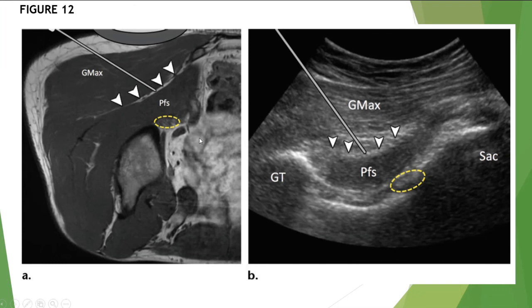So here you have the corresponding ultrasound image. It's showing the sacrum as a bone reference and the greater femoral trochanter. These are the osseous landmarks, and the needle is advancing into the fascial plane, as we saw in this diagram. It's in between the gluteus maximus and the piriformis muscle. So if we let the needle advance too far, then we would have a risk of damaging the sciatic nerve. We should always respect here the piriformis muscle so as to avoid the sciatic nerve.